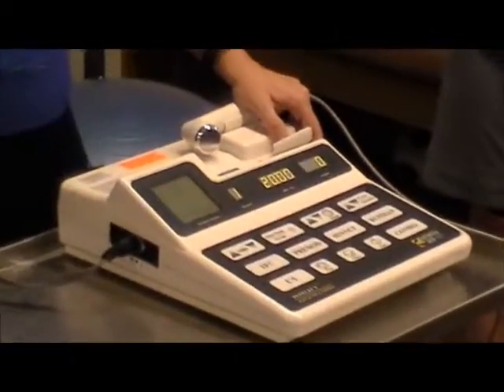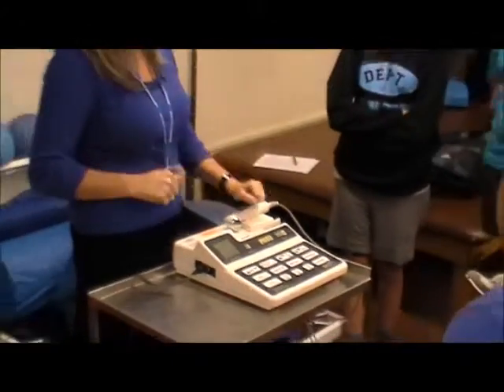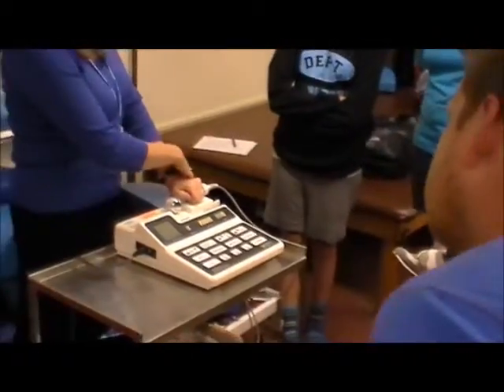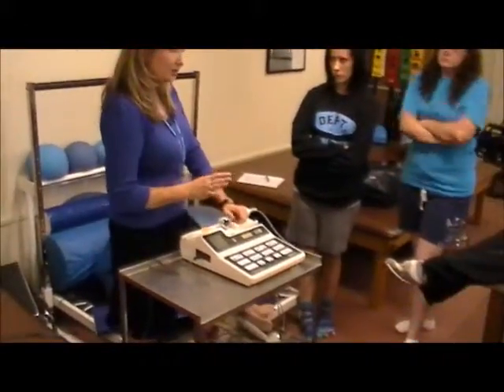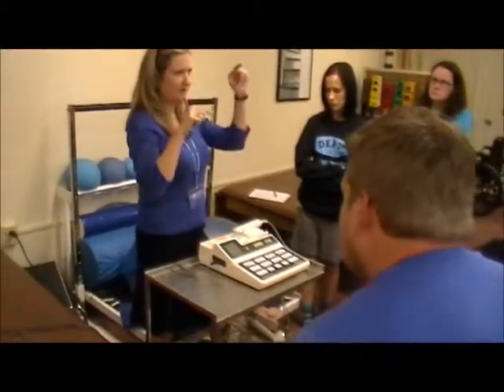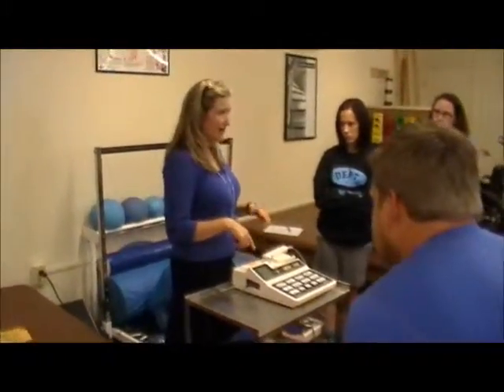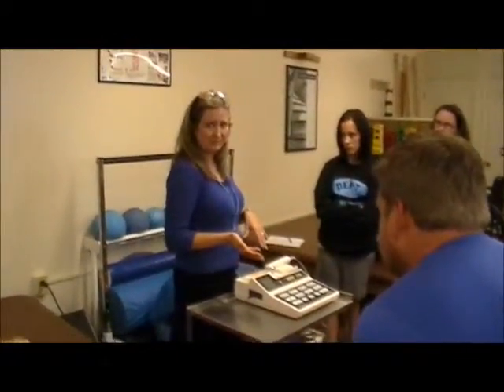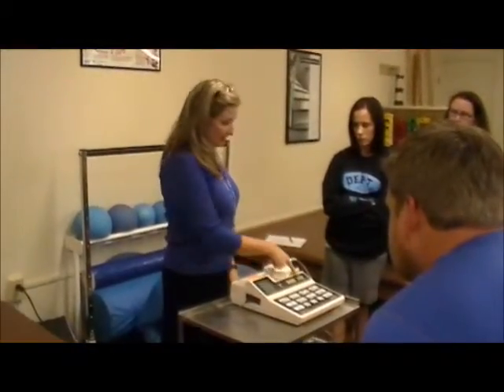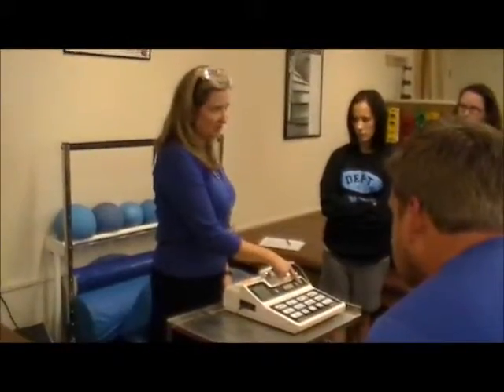Okay? Get your patient set up, get the pads in place interferentially, whenever you're going to treat, and then you're ready to hit start and turn up your intensity. On this unit, which is very different from most interferential units, on most interferential units, one intensity control controls both channels, because you're kind of wanting them to do the same thing. On this one, you have to set channel 1 and channel 2 separately. So once you hit start, the box will be around channel 1, and you set your intensity. Then move your box to channel 2 and set your intensity for that.